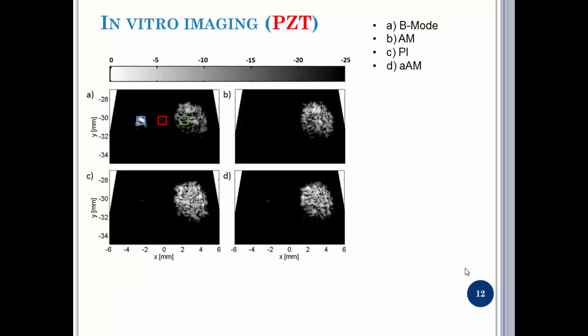So then just a few images with angular scanning. You can see here the classical phantom. You have the wire here. Here is just water, so we are going to use water to define noise. And here is a microbubble in a tube. And when you compare the images, all the images work for PZT, and there are some very small points remaining, which could be due to beamforming.